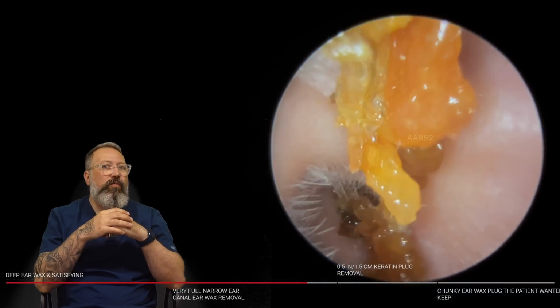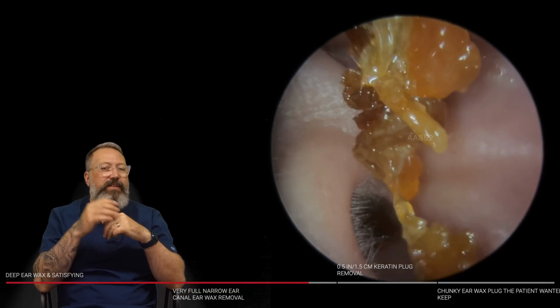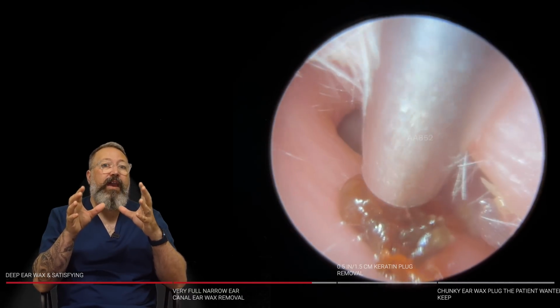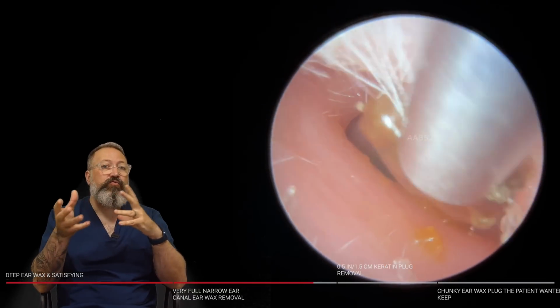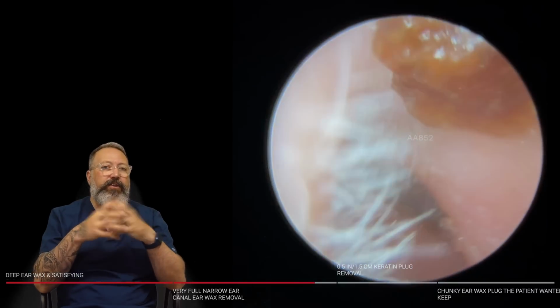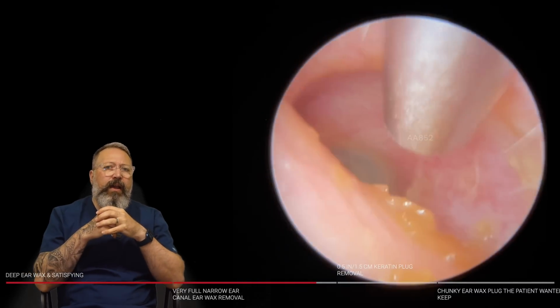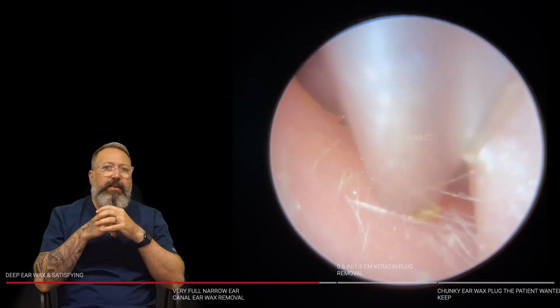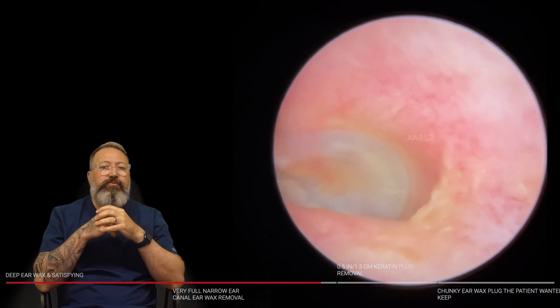It's interwoven through that entire section. So when you've got a grip on it, you can use that piece of keratin against the wax itself and draw the whole thing out. There you go, like a string of pearls. So this is coming away really, really well. Let's get this last little bit out here. There we go. And the eardrum looking nice.